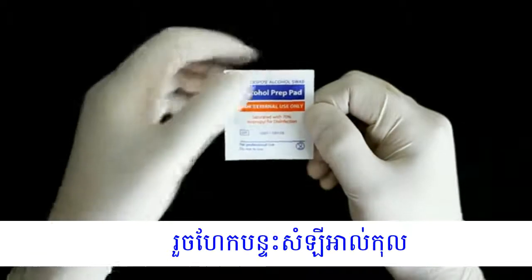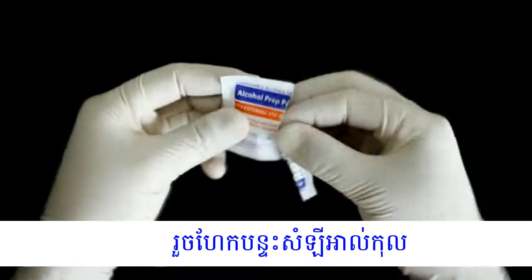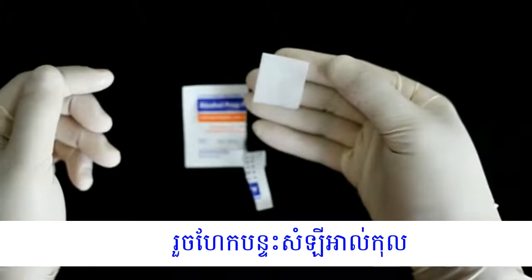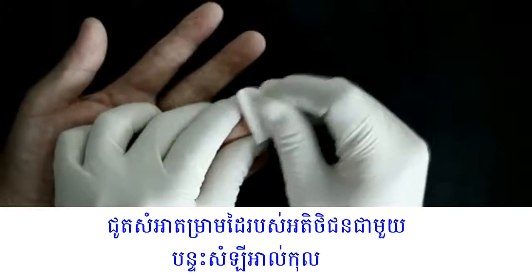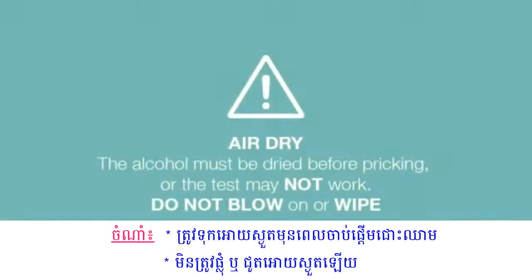Open the alcohol swab and clean the patient's finger thoroughly. After cleaning the finger, it must be allowed to air dry. Remember, the alcohol must be dried before pricking or the test may not work. Do not blow or wipe the finger when you dry.